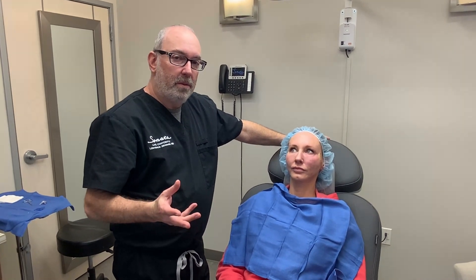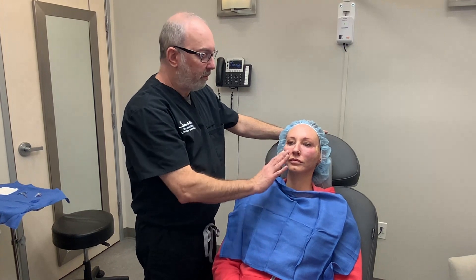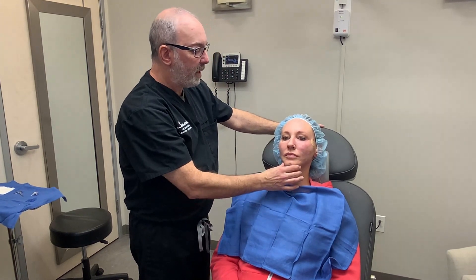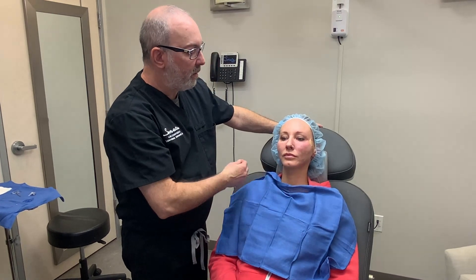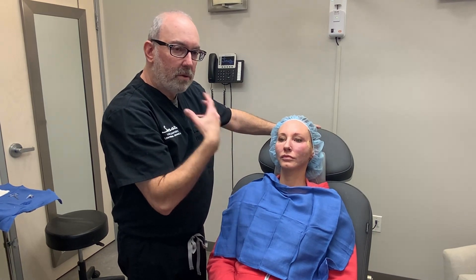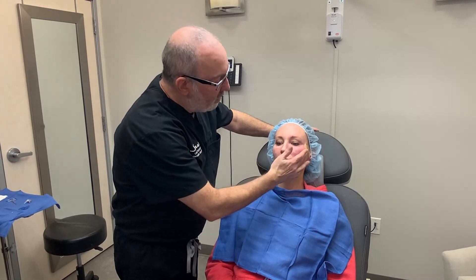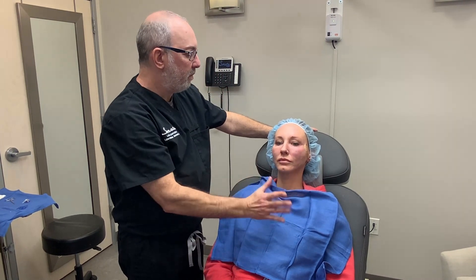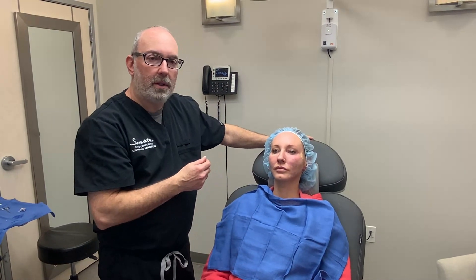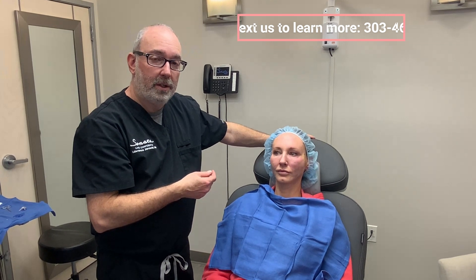We've just done the MINT procedure — it's taken maybe 15 minutes. Because we injected fluid in the face it's going to look full, but you can already notice a nice lift all along the jawline and the labial area. Once the swelling goes down it's going to look fantastic. We usually see very little bruising, but the patient can ice if they want. We tell patients to take it easy, avoid a lot of facial movement and exercise in the first week, because we don't want the threads to slip out of place. We check for any dimpling or puckering, and we can usually just press that out. There's a few days of swelling, and patients can get up to a year of benefit. That's the MINT thread lifting procedure.